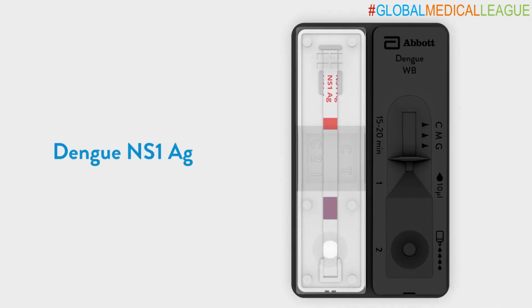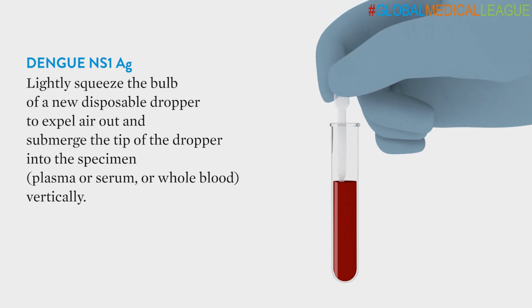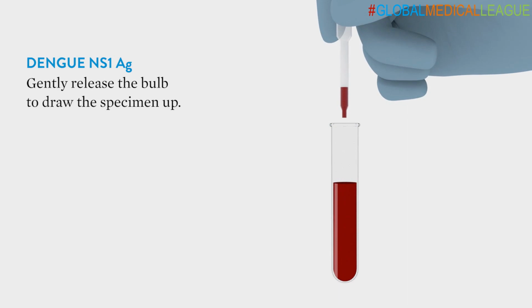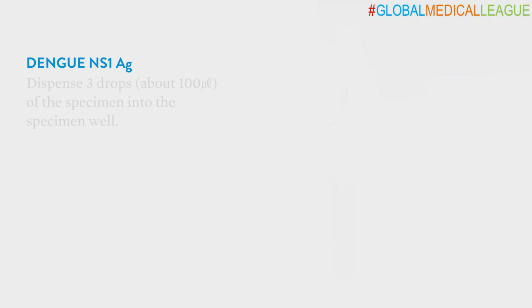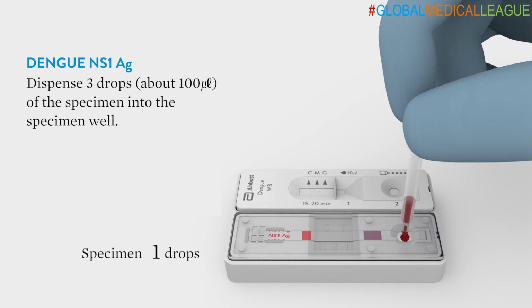Let's begin with the Dengue NS1 antigen test first. Lightly squeeze the bulb of a new disposable dropper to expel air out and submerge the tip of the dropper into the specimen vertically. Gently release the bulb to draw the specimen up. Dispense 3 drops of the specimen into the specimen well.